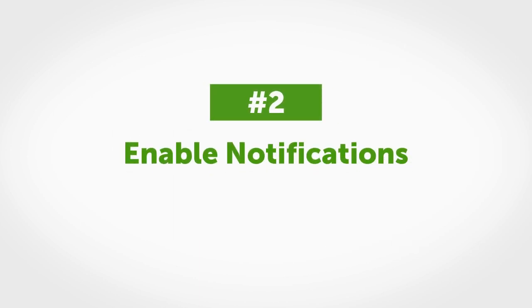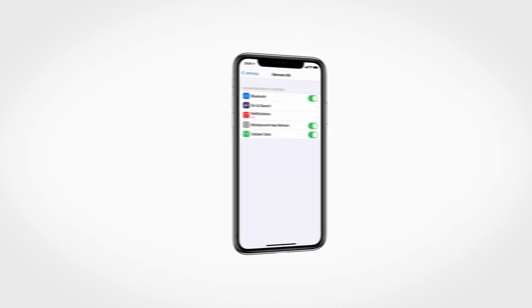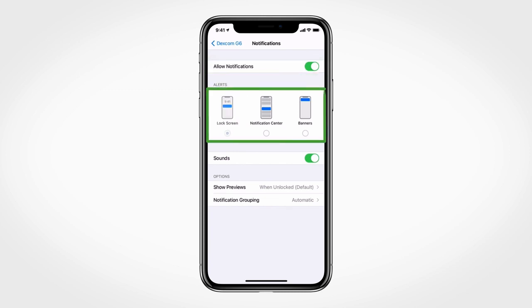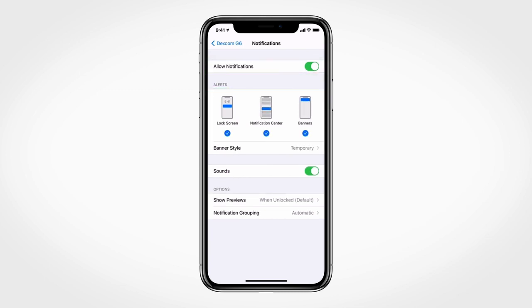Tip number two: enable Dexcom app notifications so you get alerts. Make sure you allow Dexcom G6 app notifications to show on the locked screen.